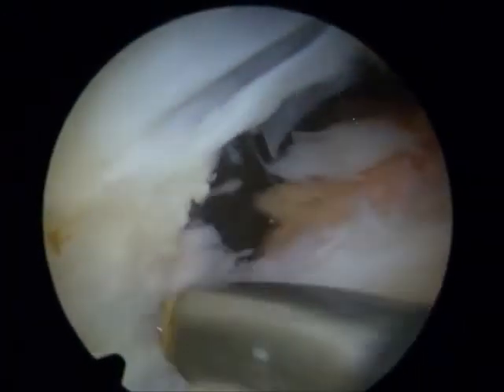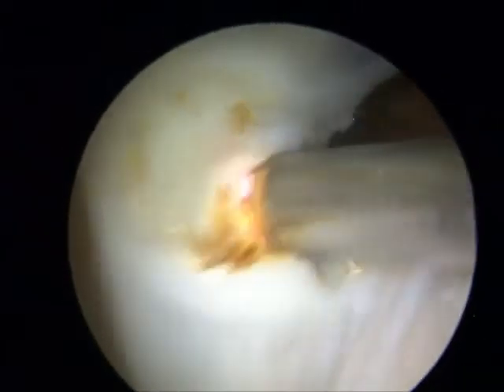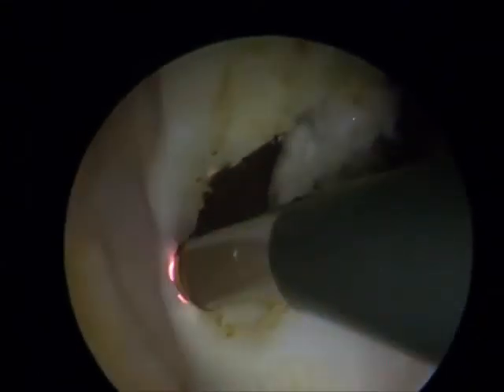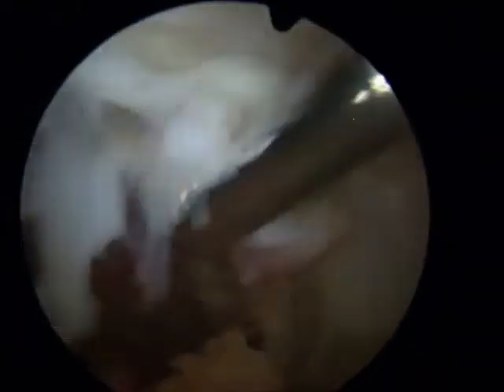There's a lot of tissue in the suprapatellar pouch, and you'll see the way to deal with the extra tissue is to use a shaver. This is the Smith & Nephew shaver I use — it's the Incisor Plus. The SupraMultivac 50 is opening up this big sheet of tissue, which most people break down in their lives. Funnily enough, long-distance runners and long-distance cyclists get a big problem if they've got a persistent suprapatellar plica, and I think it causes secondary problems with the knee joint.